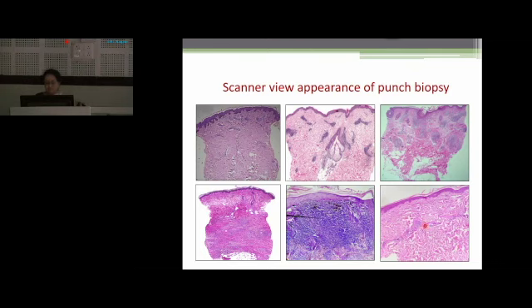In this pattern, vasculopathic dermatitis, the intensity of inflammatory cells is appearing less. It is because of increased eosinophilic content due to fibrinoid necrosis of the vessel wall. That is why blue color is appearing less. Many times, high power examination becomes essential to rule it out from perivascular dermatitis.